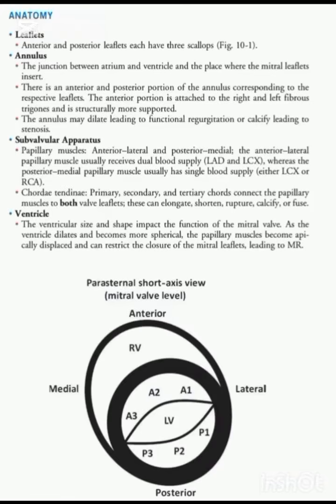In this session we will cover three essential things: mechanism, that is, how to separate primary from secondary mitral regurgitation; echocardiography assessment, from jet appearance to quantitative measures like vena contracta, PISA, effective regurgitant orifice area, regurgitant volume, and regurgitant fraction; and clinical decision making: when to manage medically, when to repair surgically, and when advanced therapies like MitraClip may be considered.